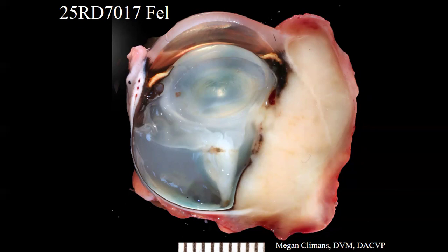So this is an 8-year-old spayed female domestic short-hair cat. Clinically, they describe retinal detachment, orbital disease, and subretinal granuloma of the right eye. Here it is on our gross view, hemisected globe. We've got our optic nerve back here, our cornea up here. We have this tan mass effect, which is involving the bulbar conjunctiva, the sclera, the orbital tissue, the episclera, and even breaking into the adjacent uvea. This was ventrolateral per our gross exam. We have a retinal detachment, with this tissue paper-like retina detached and waving freely in the vitreal space. So we'll switch to our subgross.